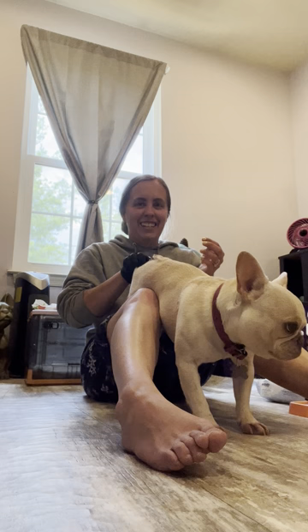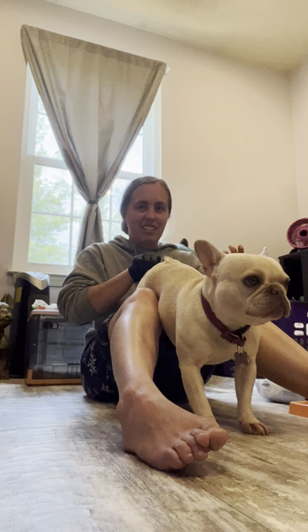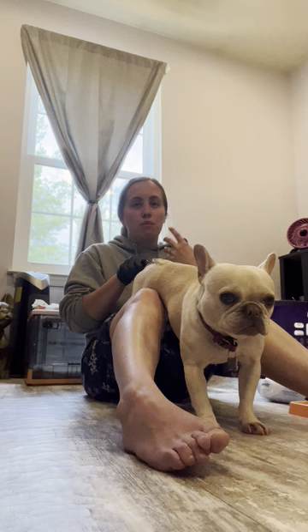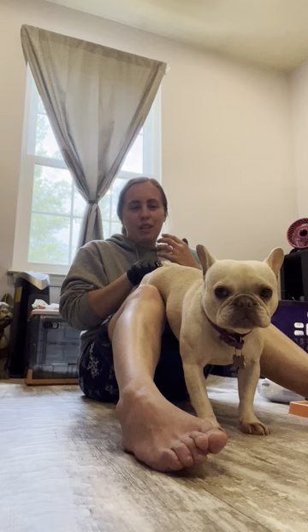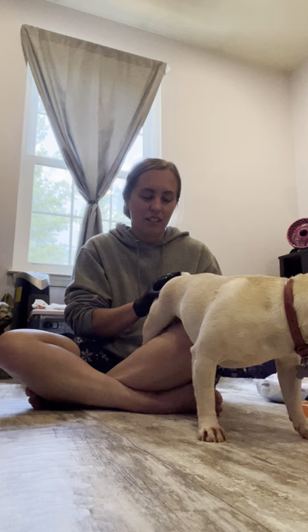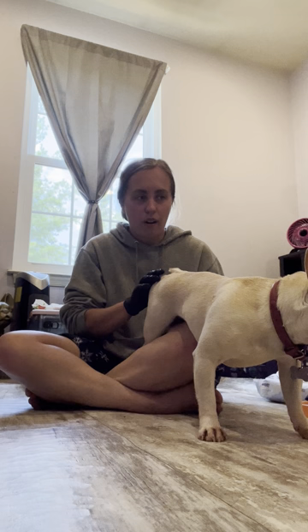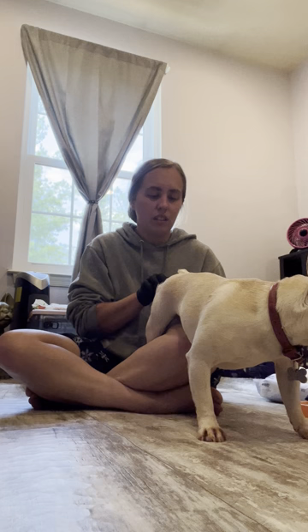When you're doing this, you're gonna rub the female on the outside, and you can also rub on the inside as well. That contracts the muscles and makes them absorb all the fluids. And she's kind of like a little fish where she's squirming back and forth. She's being very cooperative today. Yesterday, she didn't want anything to do with it. But like I said, she's not letting the boys go at her, which is fine with me. I don't want them humping her anyways. She's flirting with them, but she doesn't want them.